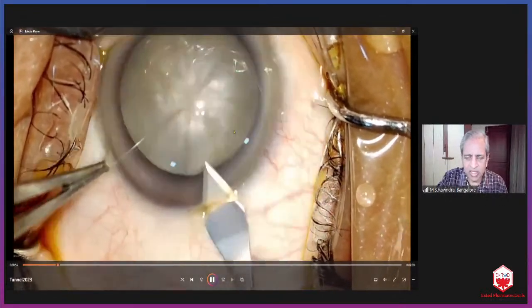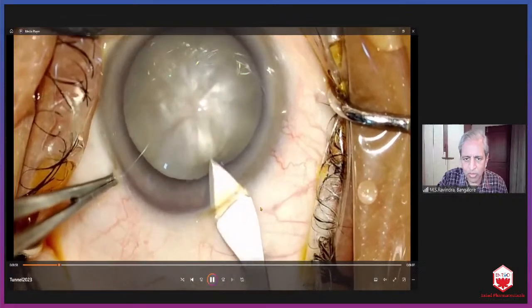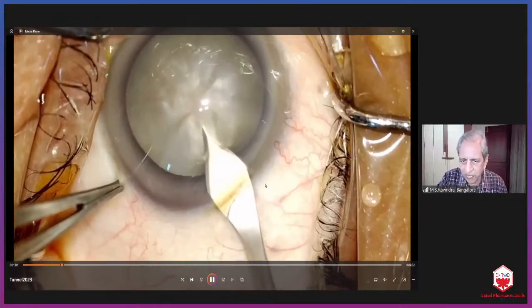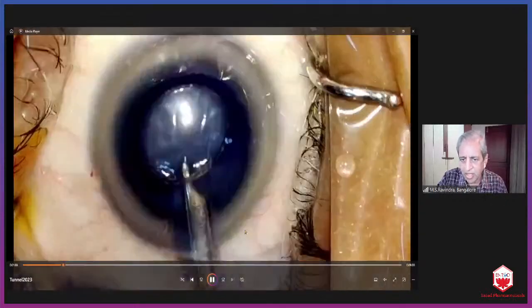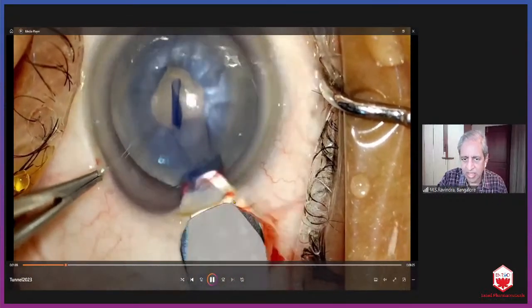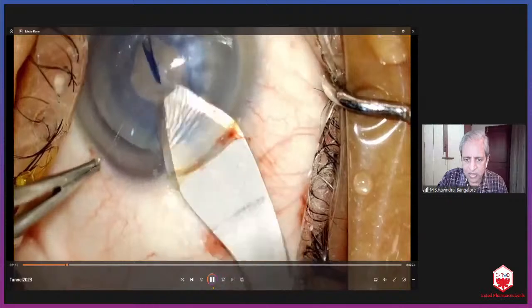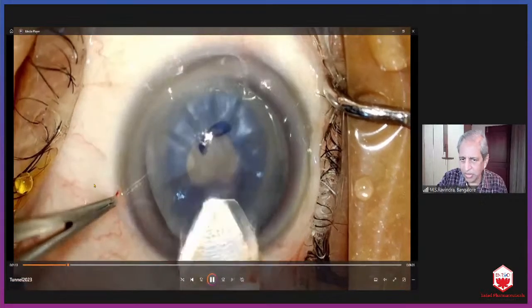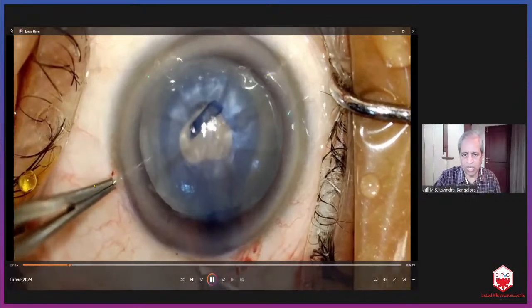Today, the same surgery, maybe about a year ago, I used to do this way. I directly enter at the periphery of the limbus, into the limbus and across the cornea, complete the rhexis, then enlarge it. Now, I'll just stop here. If you can see, the amount of sclera is very little here. I've taken a little bit of cornea, the entire limbus, and the sclera, there is a conjunctival flap there, and sclera is very little. This used to give me a surprise astigmatism, though it is on the temporal side.